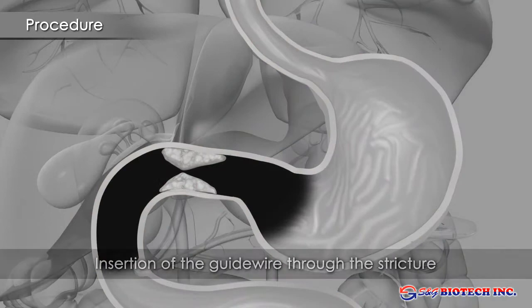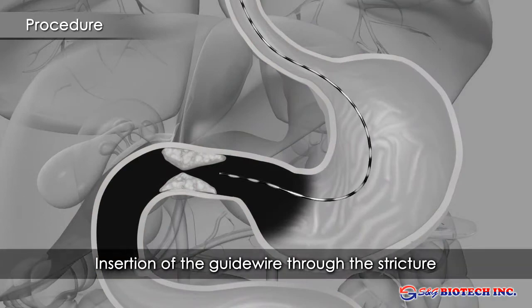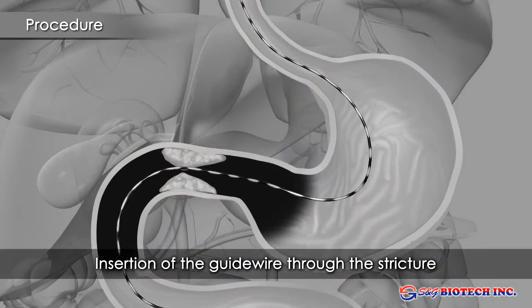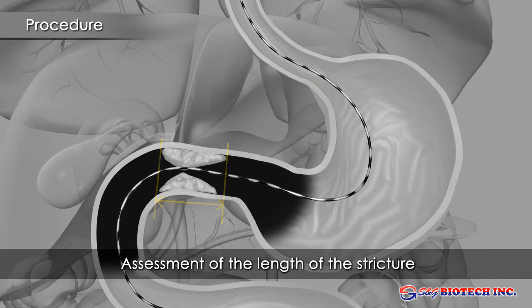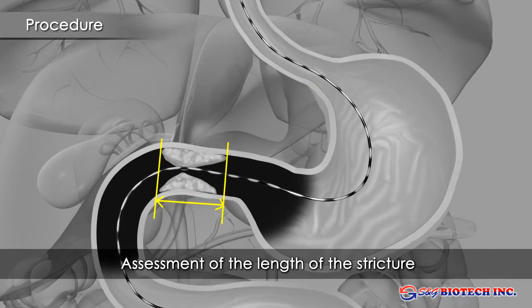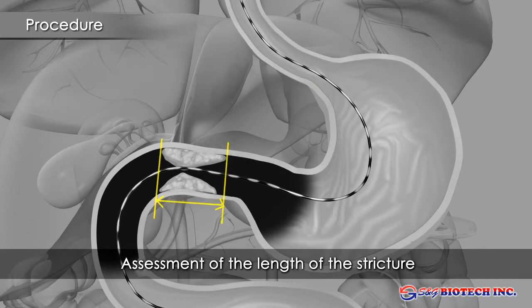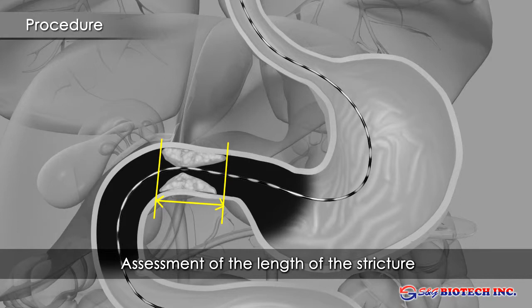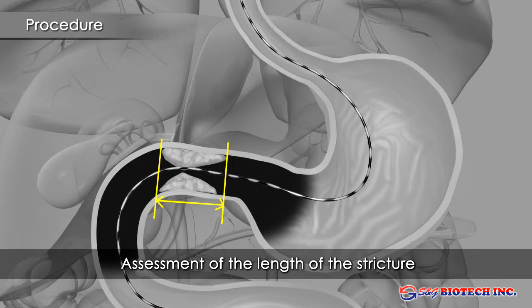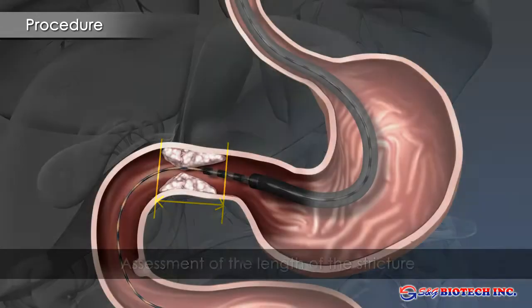Injection of a contrast medium outlines the position and length of the stricture. The stricture is crossed with the help of a hydrophilic guide wire. The wire may be used to gauge the length of the stricture. A hydrophilic wire needs to be exchanged for a stiffer 0.035-inch wire, unless a combination nitinol wire is used.